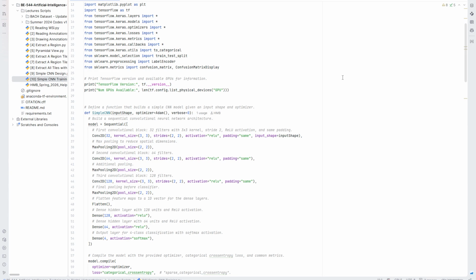Now, after understanding how to create a model using CNN by cascading the different layers like conv, pooling, and dense layers, and getting familiar with the meaning of loss functions and how to calculate it for binary and multiclass classification, and the benefit of setting a specific activation function depending on the type and the number of classes, SoftMax for multiclass and Sigmoid for binary classification, and also getting familiar with splitting the data and the type of splits, let's combine all of that together in a single script.